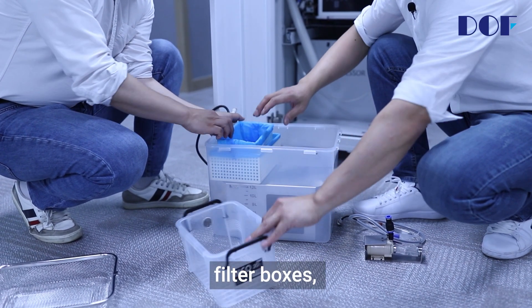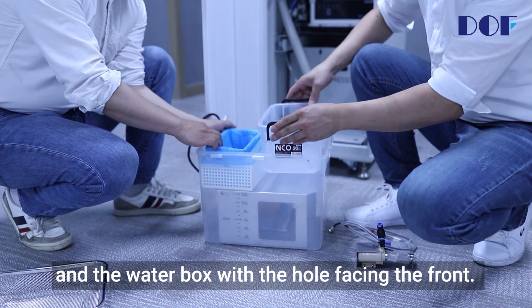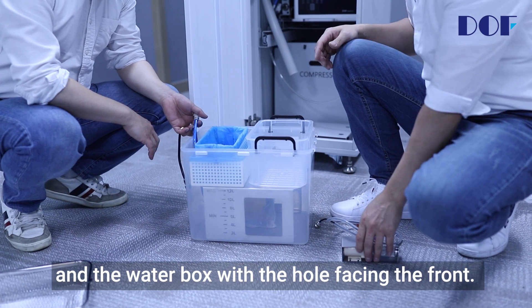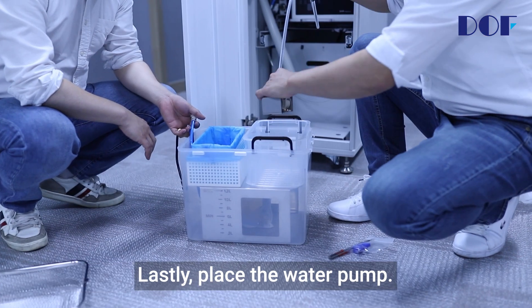Place the filter boxes, and the water box with the hole facing the front. Lastly, place the water pump.